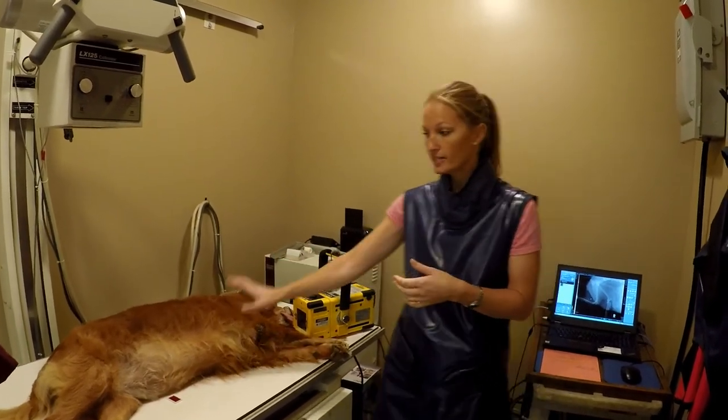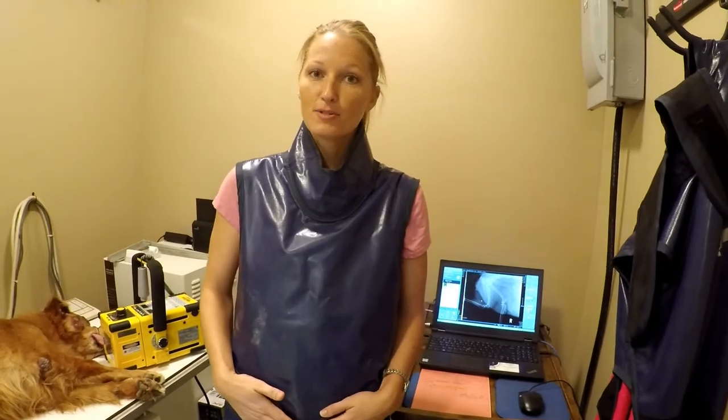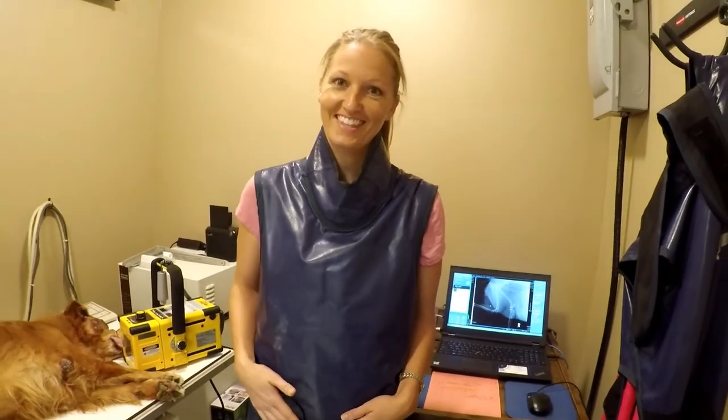We can also take chest films and abdominal films to look for different things. If you'd like to check out our machine, you can come and look at everything on October 21st at our open house. We'll see you then.